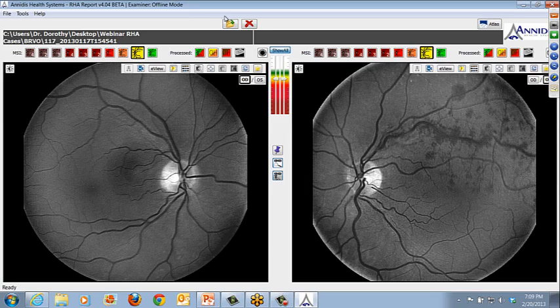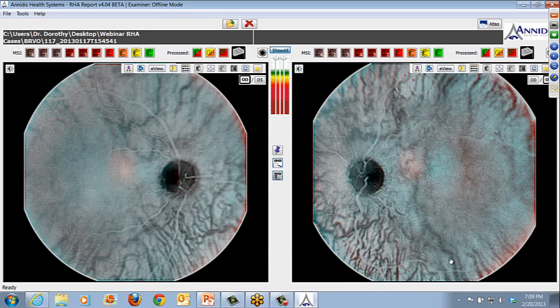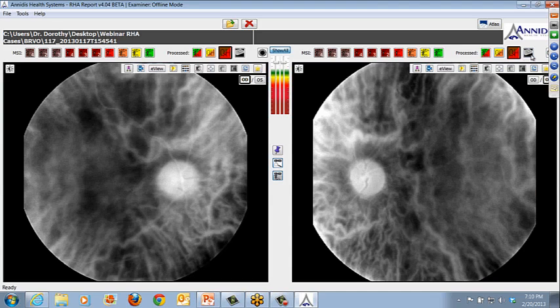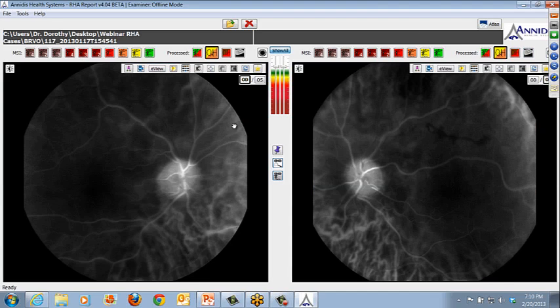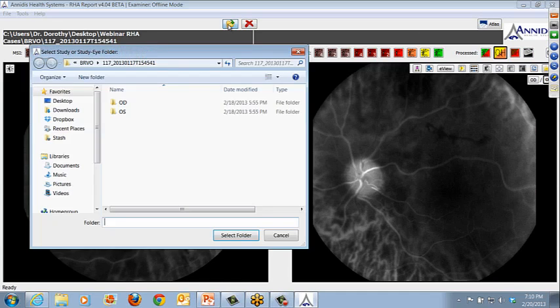Do you also suggest maybe just looking at the stereo view and seeing if there's elevation there? Yeah, you can also look at the stereo view as well. You have to remember that stereo view is created from anaglyph. So if you have other views that are used in creating that anaglyph, they're not perfect, that will be off. So again, you have to go back and look at all the images and make sure that the combination that creates that is good. And I'll actually show you some other examples of that.